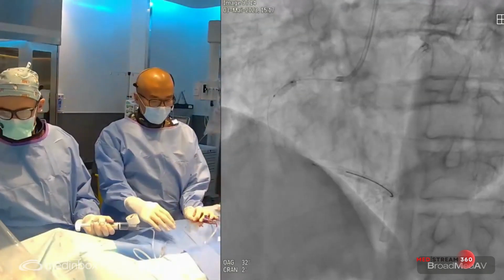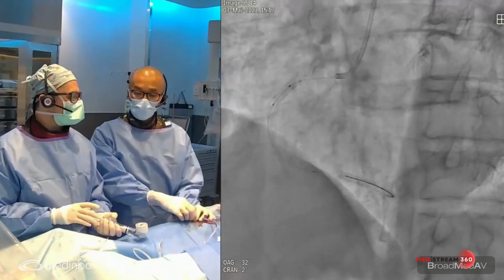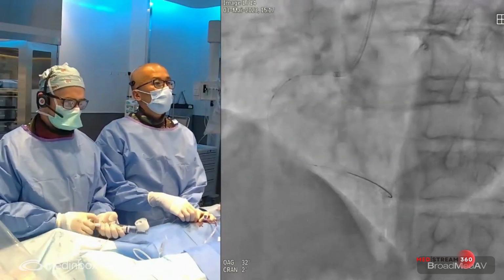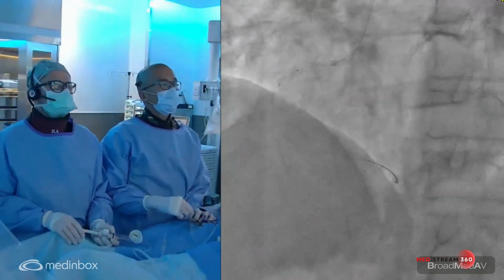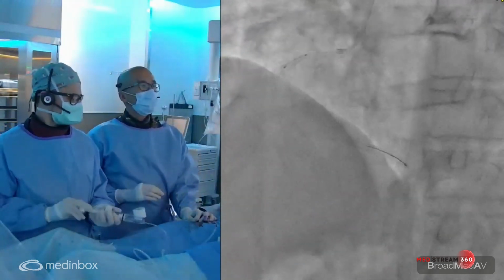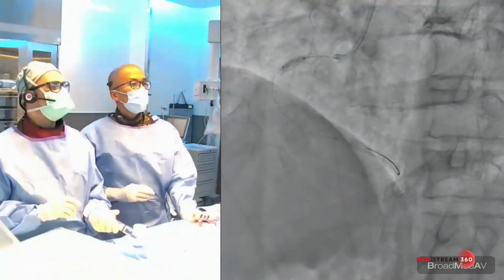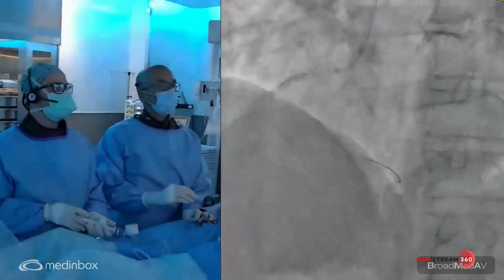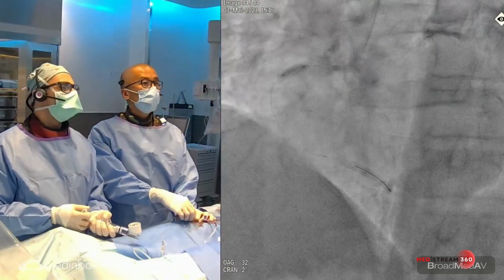I'm at 8. So this is around 3.15 millimeters. We actually measured inside the stent. The stent is a 3.5. It looks like it was expanded around 3.4 millimeters. Off. So initially we found in the initial reports from 2009, it was a BMS 3.5 by 14, which was not post-dilated. This is the maximum rated pressure, 3.28 millimeters. Off. Looks like a good expansion.